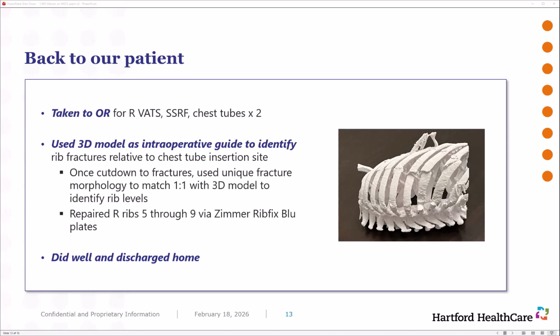Also have in the chat here that Dr. Zakaluzny did a single non-union rib printed with the rib and pre-shaped the plate, real-time saver, one case experience. And that was the question I had for you: how much time did this save you, or how much time do you think it saved you? I'm sorry, are you asking me or Dr. Sakaluni? Oh, I'm sorry, I was asking the group.